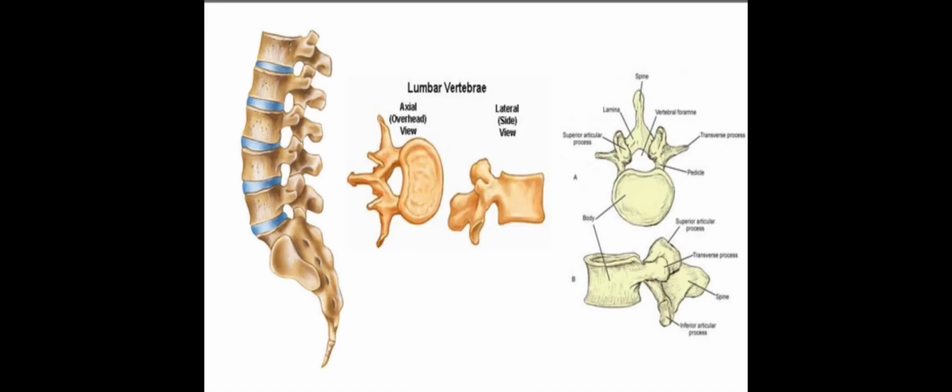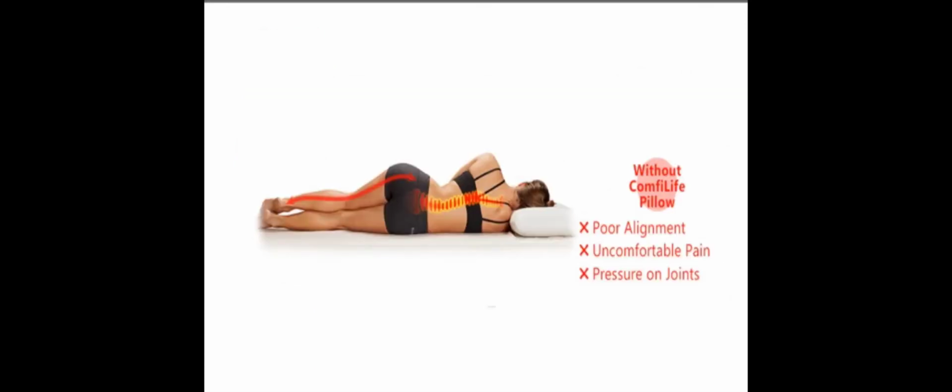When you look at the anatomy of the lumbar vertebra, we have the body, the pedicle, the lamina, the spinous process, the transverse process, and the superior and inferior articular processes. When the patient comes to the department, the patient will lie in the lateral recumbent position with the knees flexed, the head on a pillow, and the mid coronal plane aligned with the CR and the IR on the table, and we expose on suspended respiration.